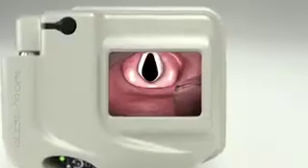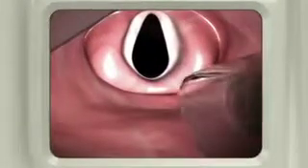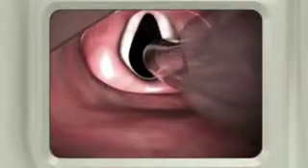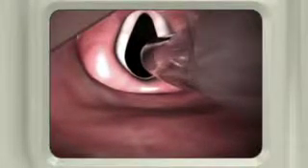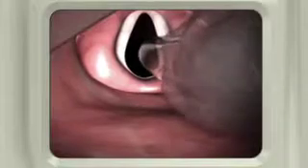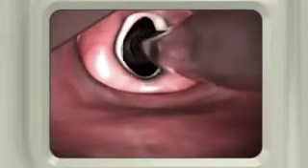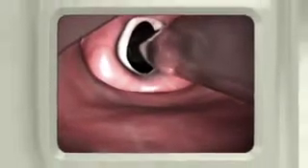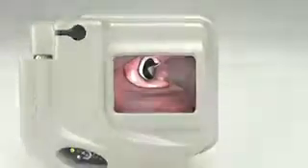In Step 4, focus on the video monitor as you advance the endotracheal tube. Returning your eyes to the video monitor gives you a view of the glottic aperture, and near it, the tip of the endotracheal tube. Sometimes a slight withdrawal of the Glidescope is required to reduce the viewing angle and allow the glottis to drop. The tube is then advanced by gradually withdrawing the stylet 5 centimeters as the tube moves forward. Viewing the entire insertion step on the video monitor allows you to quickly and gently rotate or angle the tube using the right hand to redirect as needed.